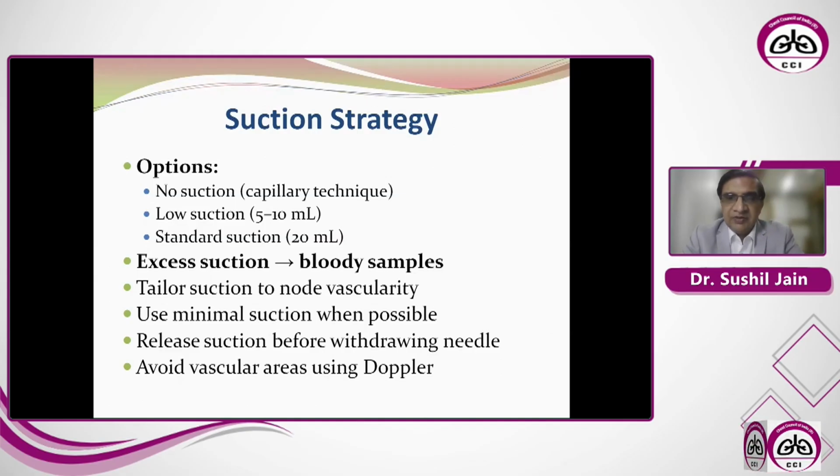Tailor suction to node vascularity. Use minimum suction when possible. Release the suction before withdrawing the needle, and avoid vascular areas using Doppler. Now, though different suction techniques have not shown any additional benefit in clinical trials, most of us use suction during EBUS TBNA. However, even if you don't use suction, your diagnostic yield doesn't change much in the majority of patients.